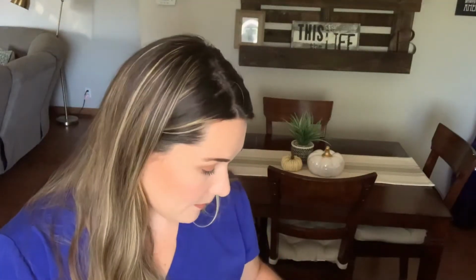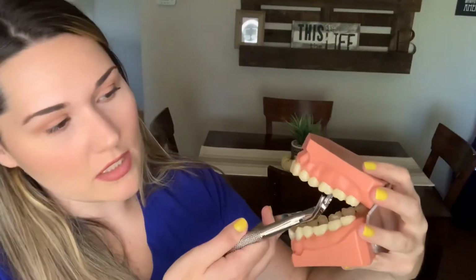So since we're extracting an upper tooth, I'm gonna give him the 150. Now this is a 150 AS. This one's shaped a little bit different than the one I use in my office, but for pretend, this is what I'm handing him. So when you hand the dentist a forceps, you wanna hand it like this, okay? Because you want him to grab onto the handle. You don't wanna hand it like this because he's not gonna grab that way. He's gonna grab up here. So hand him the forceps like so. And then what he will do is, since the tooth is already loose, he will grab onto it like this.